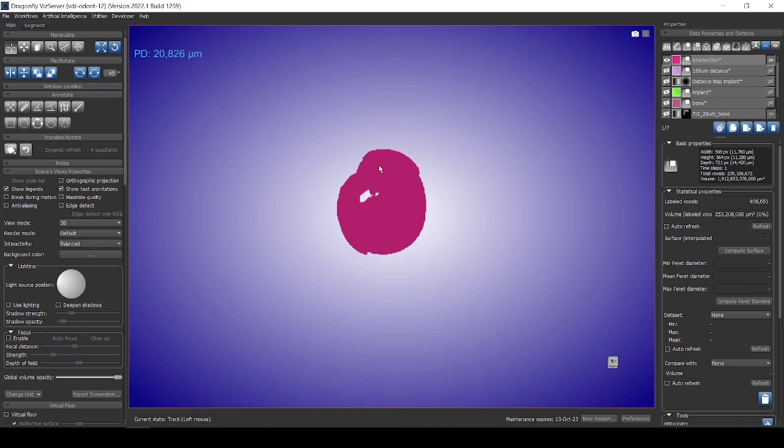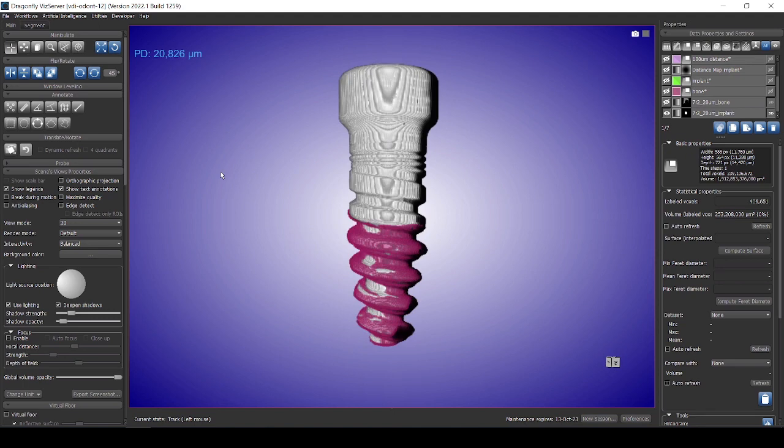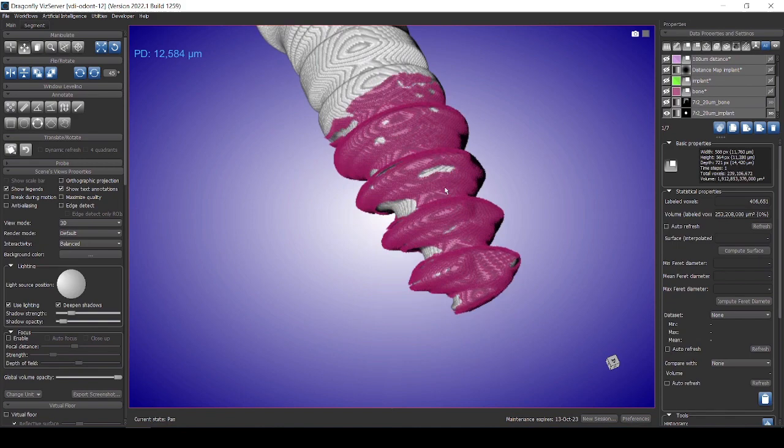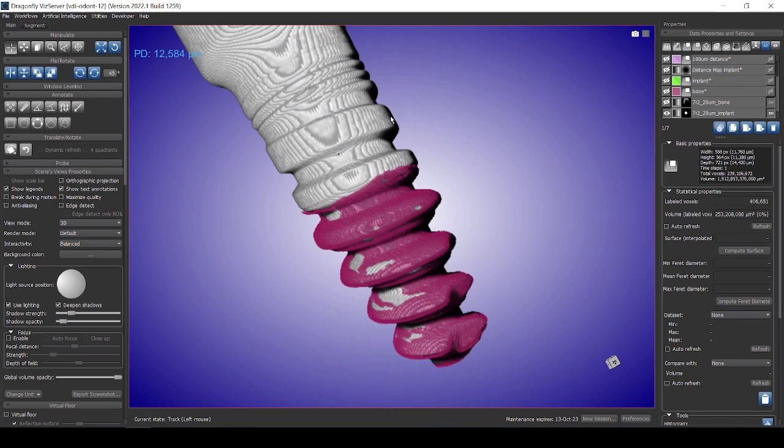So if we go back here, let's look at this with some lighting. And maybe we can put the screw, the original one here together. And now we have an image showing regions where there is a gap actually in the bone growth. So there was no bone in contact with the implant in these regions.